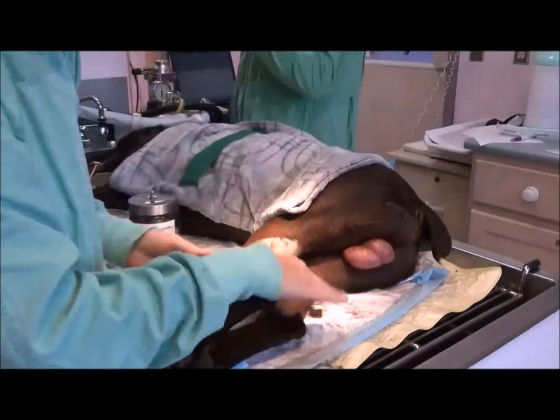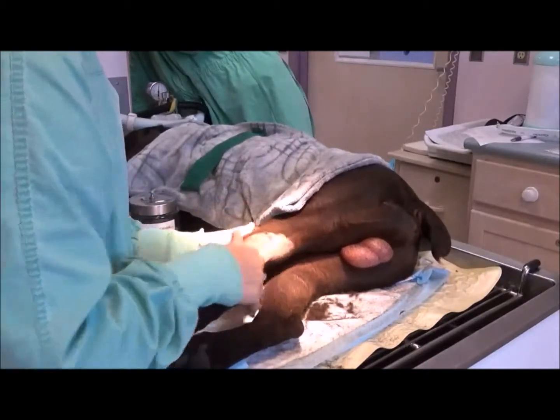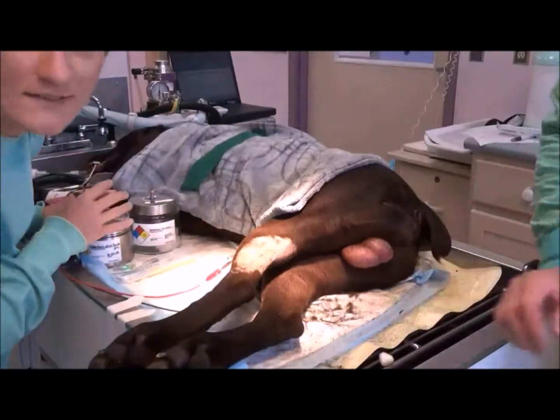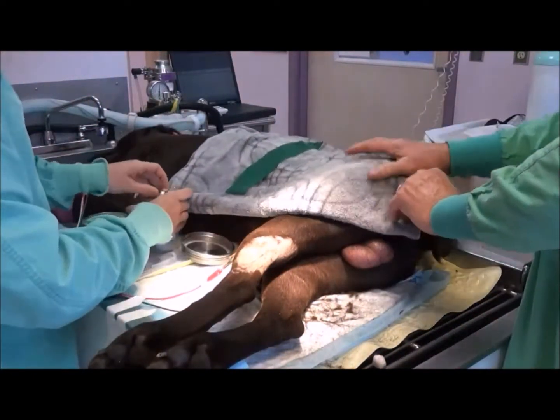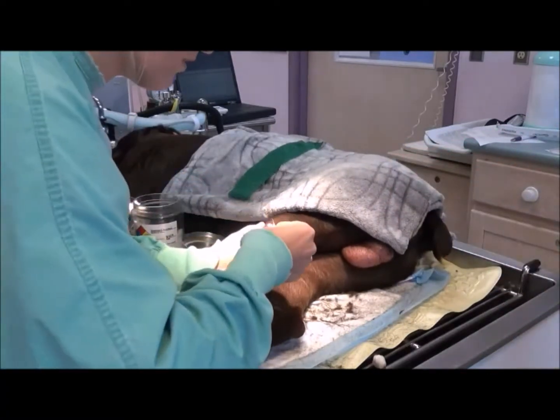Just going to get any hair out of the way. And now I'm going to cleanse the area with chlorhexidine scrub. I'll do 3 cycles, and then I'll follow each chlorhexidine scrub with an alcohol rub.